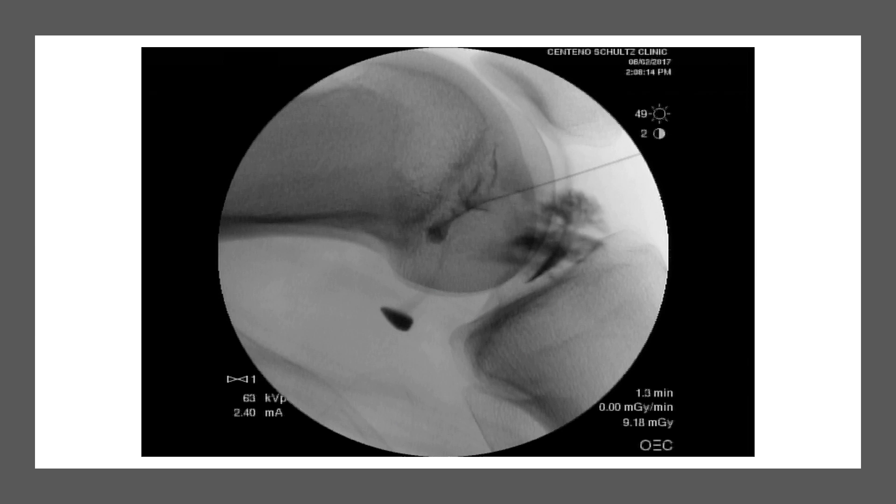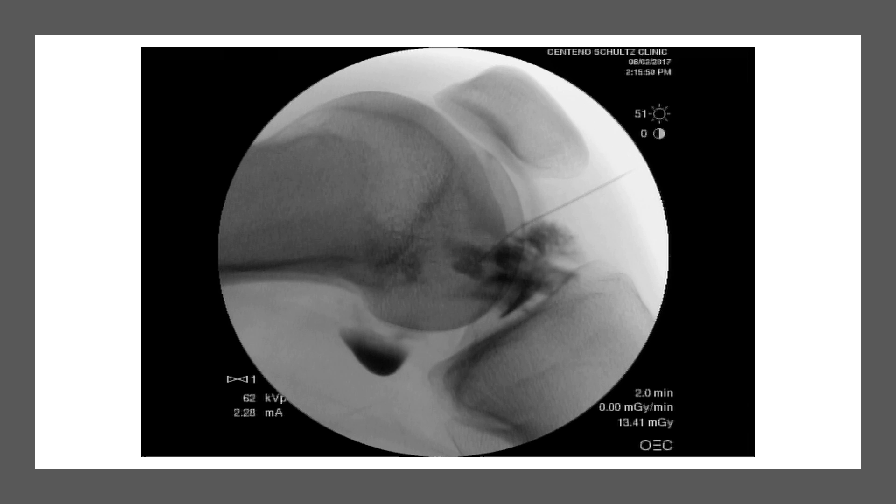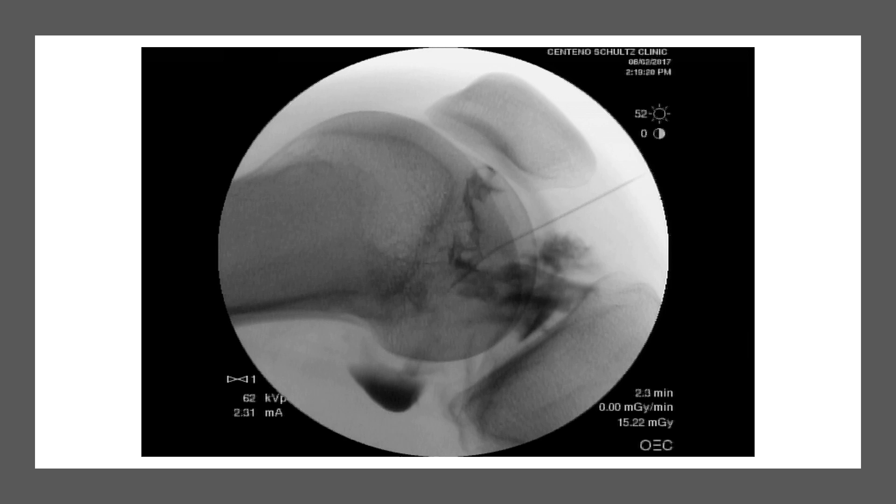I've got to go to the ACL origin. I've repositioned my needle to go to the ACL origin and get a little bit more coverage up into this area. So I've got coverage at the bottom and the origin, but nothing in the middle. I start trying to work on the middle — getting a little coverage up front, then a little bit more. Finally, I get most of the way there, but I still have not been able to really cover this back piece. This is as much as I can get coverage in that bundle.